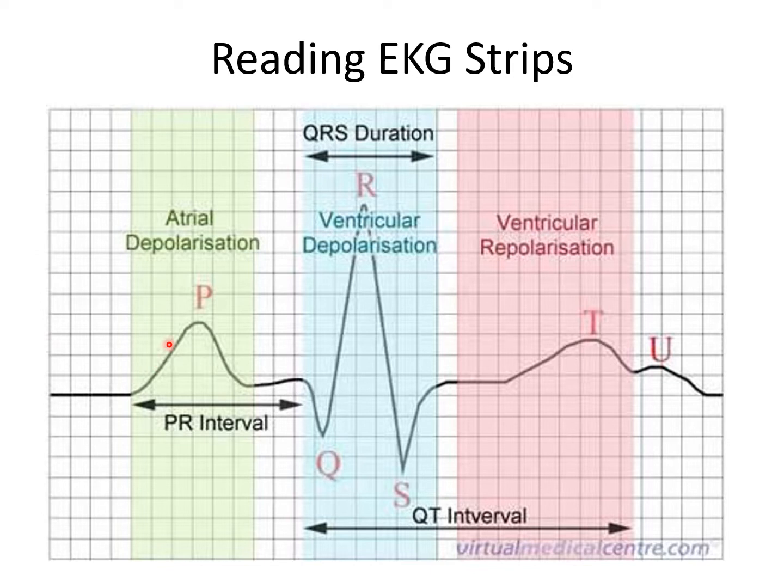So we'll stick with the P. First downward deflection is your Q, R, S, and then your ST segment, but your T here comes back down. So this whole line that we're talking about here, when we talk about positive and negative deflections, is referred to as the isoelectric line. Okay.